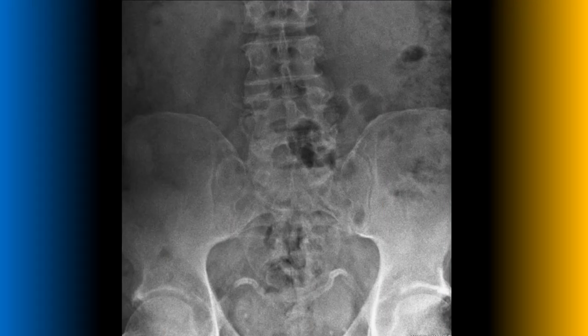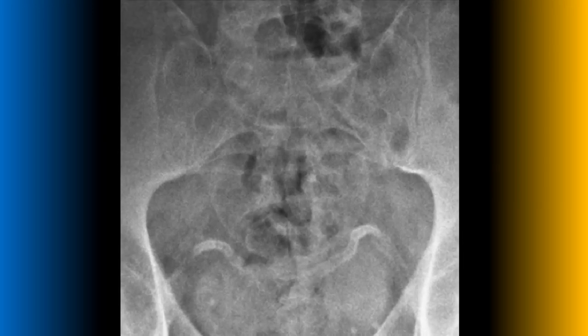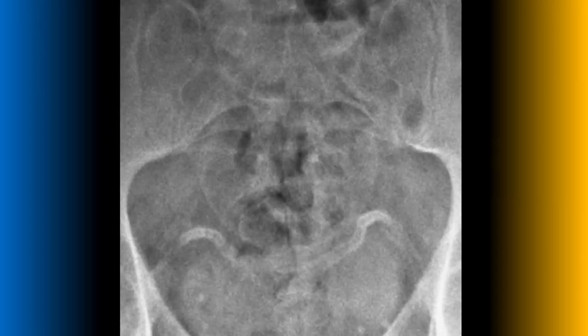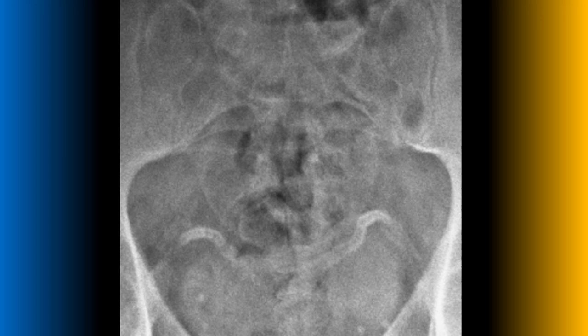Here's a frontal lumbopelvic radiograph. Looking closely at the pelvic basin, you should notice a serpiginous tubular conduit wall calcification extending inferomedially on both sides of the pelvis. This is seen only in males and represents calcification of the vas deferens.